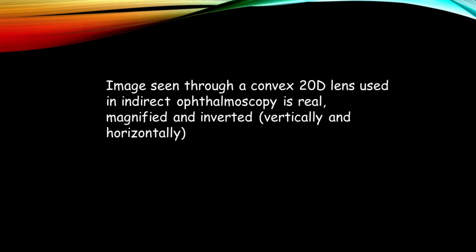The image seen through a convex 20 diopter lens used in indirect ophthalmoscopy is real, magnified, and inverted vertically and horizontally. The location which I will be describing will be on the basis of the quadrant which I am examining.